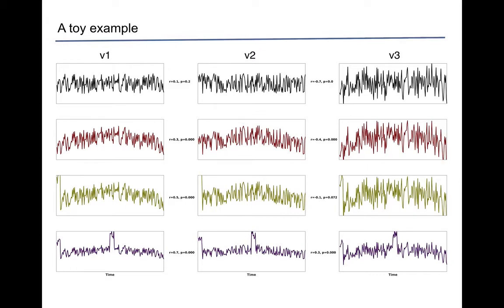I just wanted to emphasize this at the beginning, so we can be more careful about what we are doing with the data and how we are doing the pre-processing steps, because sometimes we can even artificially induce some relations between different voxels, basically masking the true relationship between them.